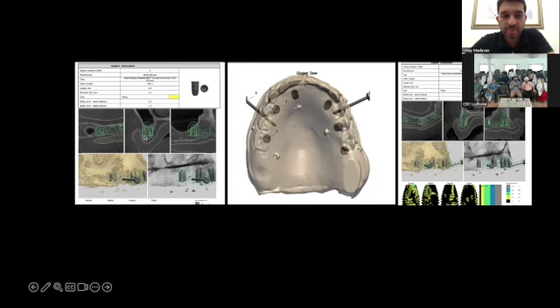Typically for an overdenture, you need about 10 to 11 millimeters. That includes the locator housing, the pink part of acrylic, and then the teeth. So that's the reason why you want to have your tooth setup. If you did not have the tooth setup, there is no way for me to figure out how deep I want to place the implant, because as you see in this area, we're actually entering the sinus, but also we need a little bit of plasty there. So if we don't have that plasty done, you're going to have a very thin denture, and if you start trying to pick it up with locator housings, the denture is going to be even weaker and more prone to fracture.